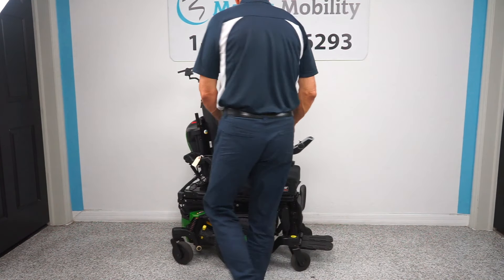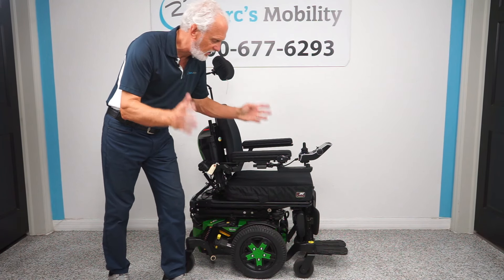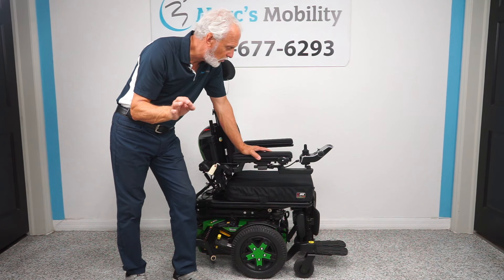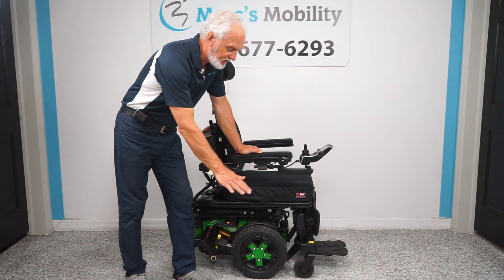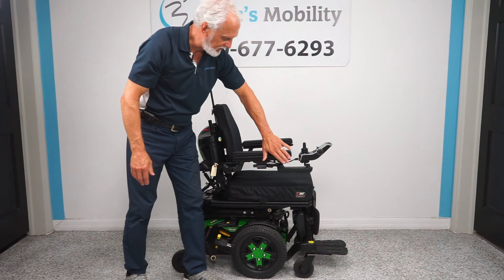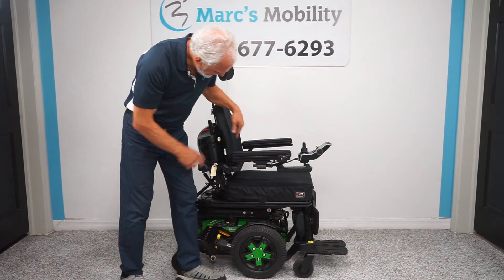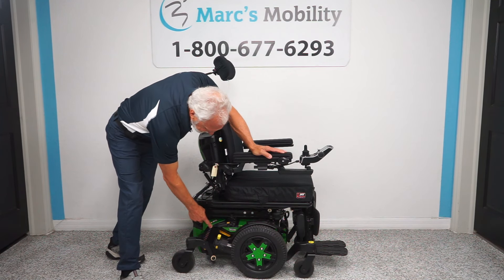Let's do a recap on this chair. This is a Quantum Edge 3 Stretto — the smaller size — only about 21 to 22 inches wide, giving you that extra two to three inches to get through a door. It has the 12-inch seat lift, the electric tilt, the electric recline, the electric feet, the swing-away joystick, lights, gel arms, adjustable headrest, memory foam cushions, a J cushion, solid tires, anchor points, and suspension all the way around.